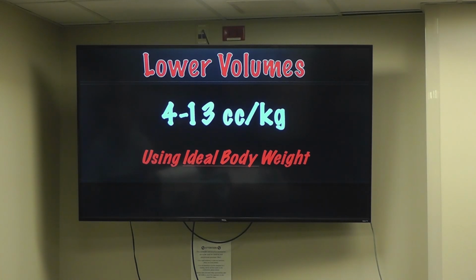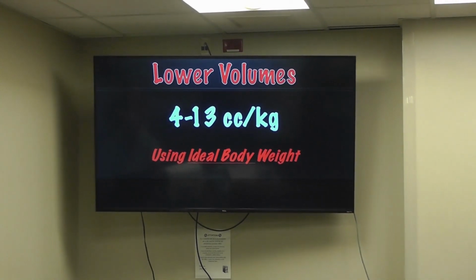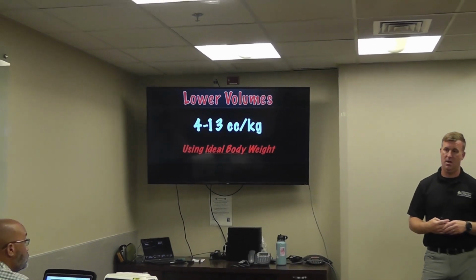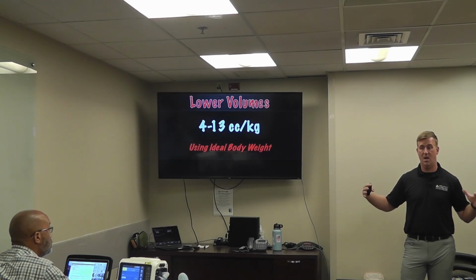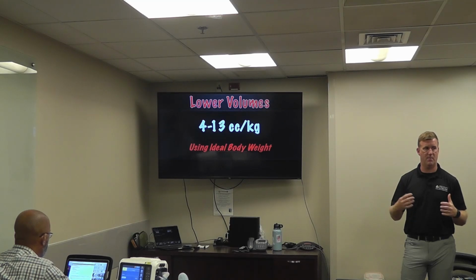On the other hand, I've got my COPD emphysema patient who's got big, giant trash bags for lungs, right? They got these huge lungs. Let me take advantage of their huge lungs and then give them lots of time to exhale that out. So I might set them at a rate of 8 and give them 1,000 cc tidal volume. Their peak inspiratory pressure is going to be super low because they got these big giant trash bag lungs, and then I give them forever to exhale. Okay, and we're going to talk about cycle time and I time and breath rate here in a second.